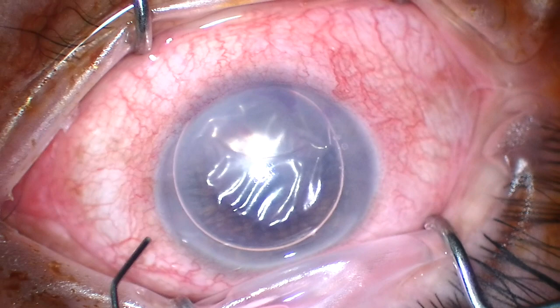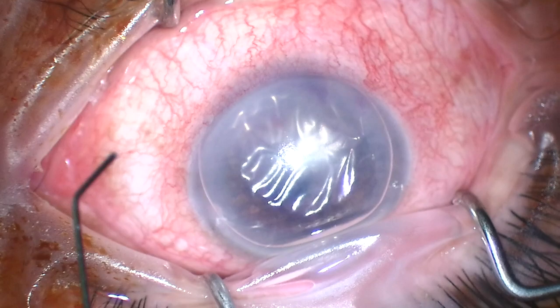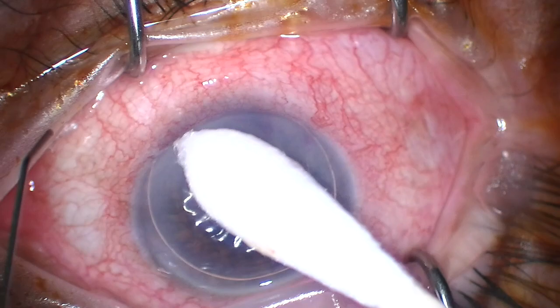I tried to stroke the cornea from the surface in the hopes that I could milk some aqueous from the cleft in Descemet's membrane, but that was not easy to do. I then switched to a Q-tip to accomplish this. We're not rubbing with the Q-tip so we don't disrupt the epithelium — I'm simply rolling to get a little broader pressure across the surface of the cornea.